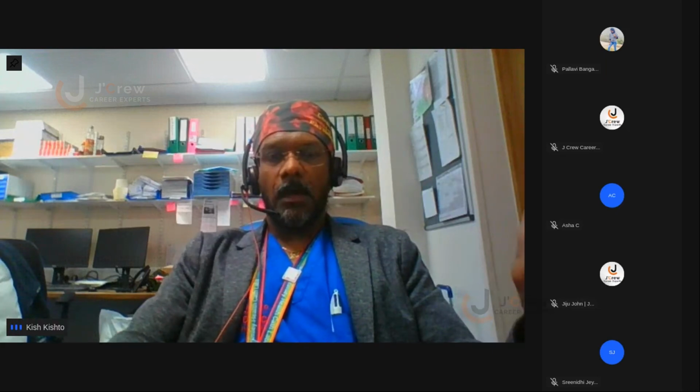Can we, in terms of reporting and in terms of image acquisition, has anyone noticed a pattern in my echoes?